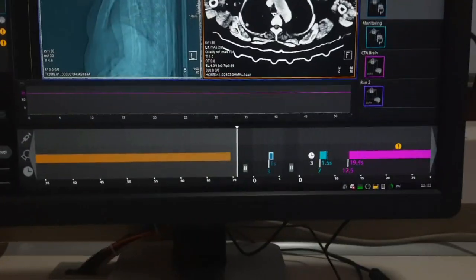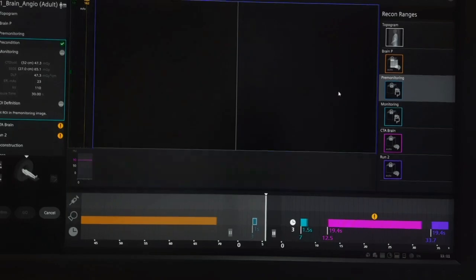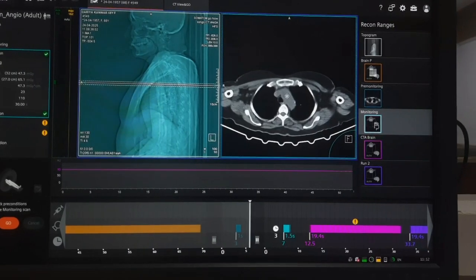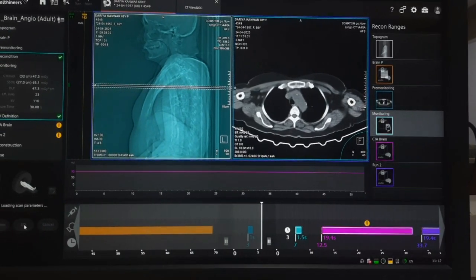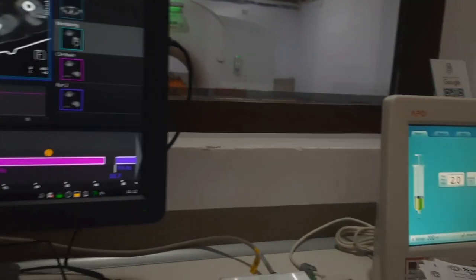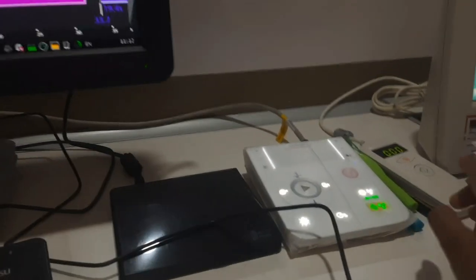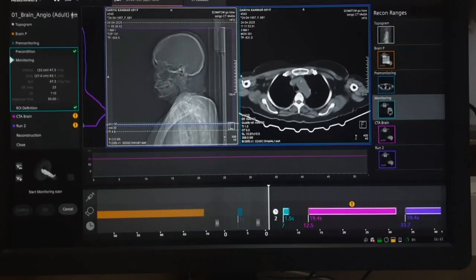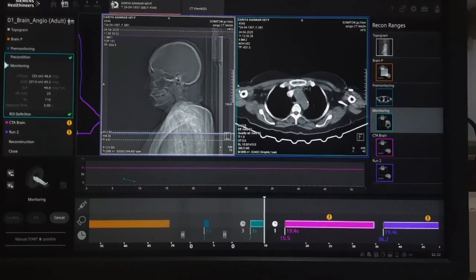Press go, press move, then start. Put the locator on the ascending aorta and go. Also check your patient flow rate and the amount of contrast you are giving to the patient. Press start. As contrast is seen in the heart, the scan will automatically proceed.